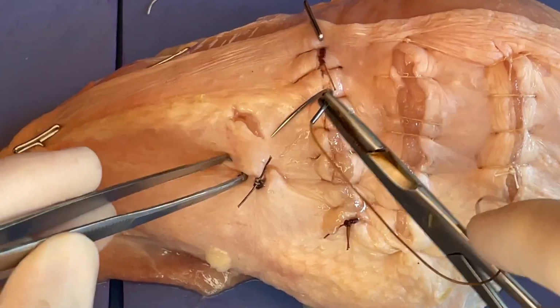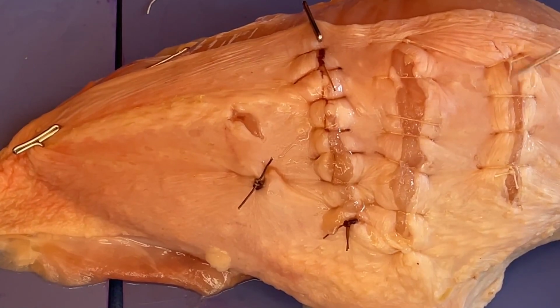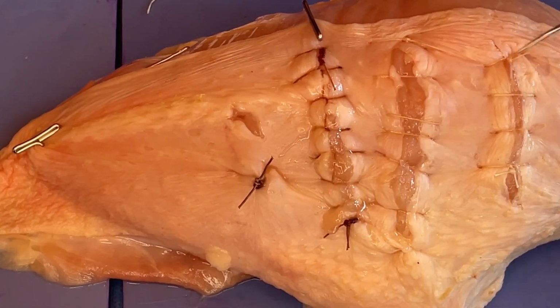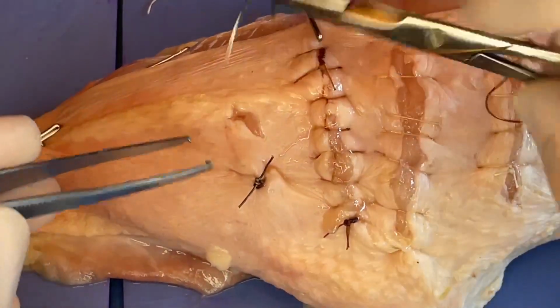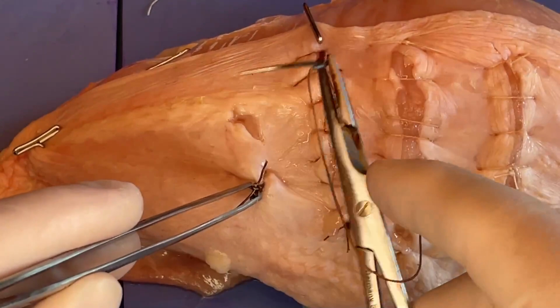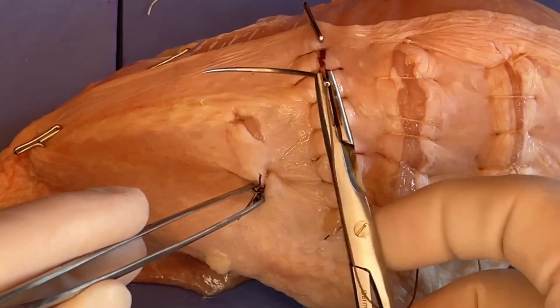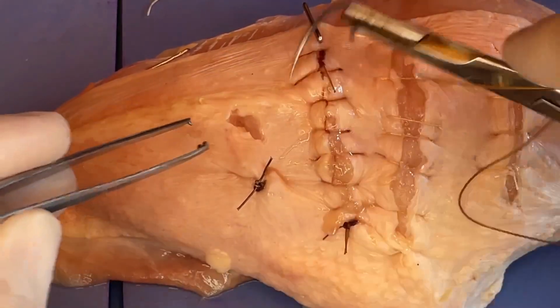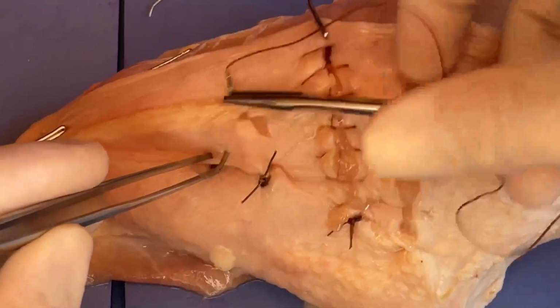Maybe 1 or 2 interrupteds, but like we saw over here, the tissue between the loop of interrupted, there's not a lot of tension here in between. So for a figure of 8, and the one we did down here, we went kind of horizontal, I guess, to the defect itself. So this time let's go vertical. Let's start here.